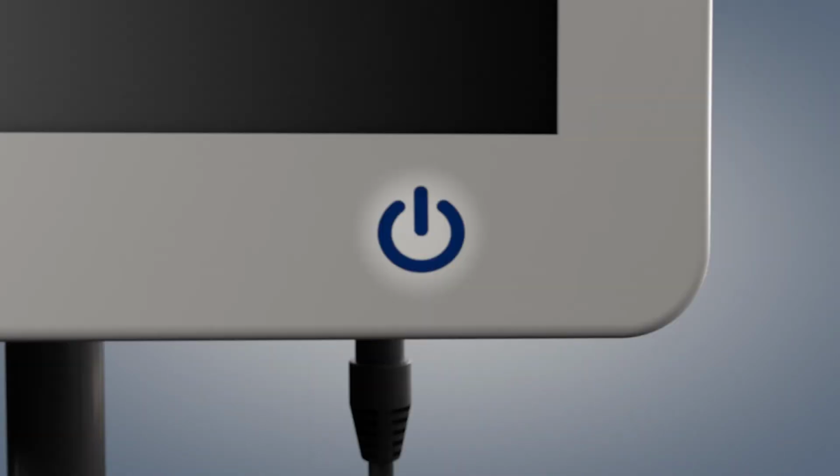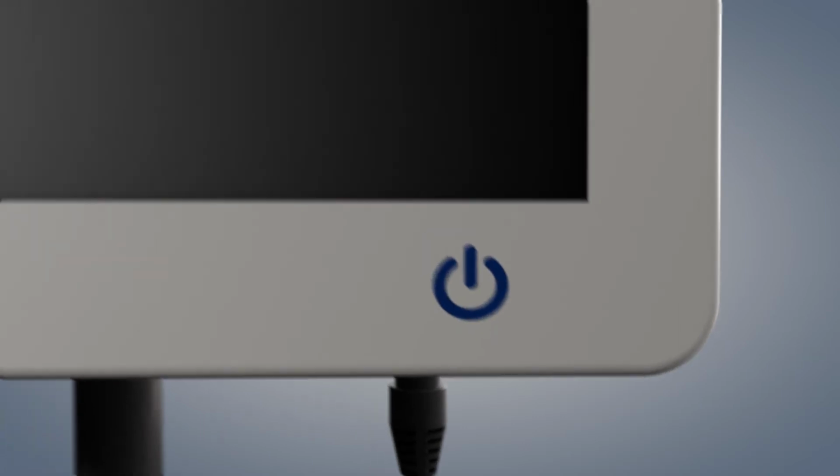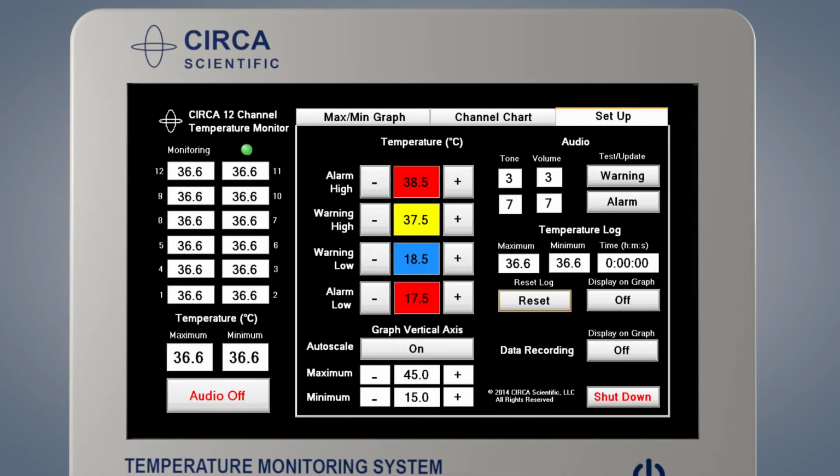Switch on the CIRCA monitor by pressing and holding the On button on the front of the monitor until it glows blue. Release the button when the blue light appears. The program may take up to 2 minutes to start. When the monitor is first switched on, the setup screen will be displayed within 2 minutes. Assure that appropriate temperatures are shown on all 12 sensors.